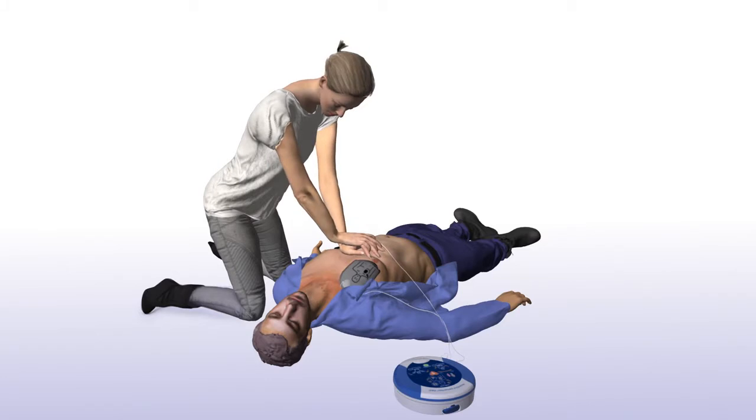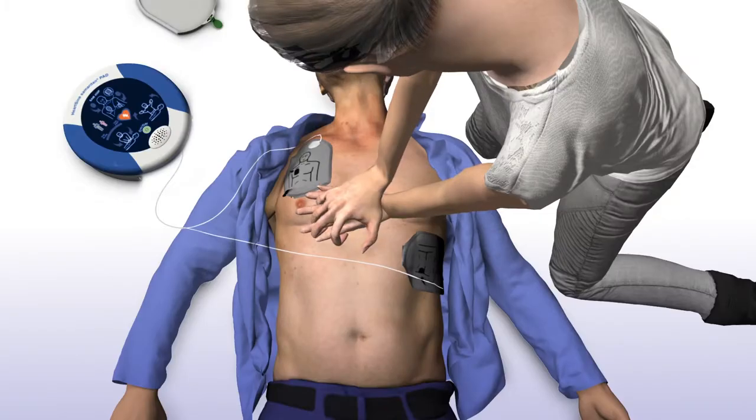The SAM 450P will tell you how and where to place your hands, as well as provide you with real-time audio-visual feedback on the rate of your chest compressions. Place overlapping hands in the middle of chest. Press directly down on the chest in time with the metronome.